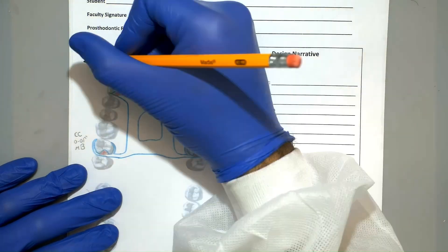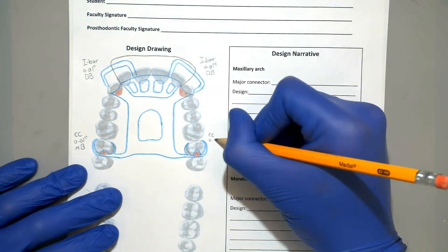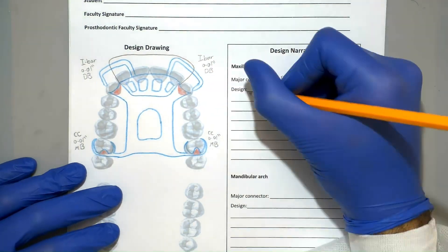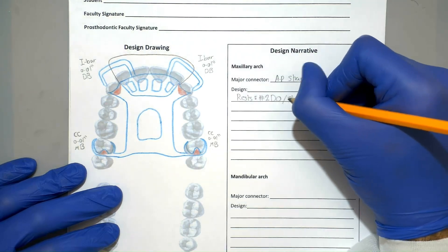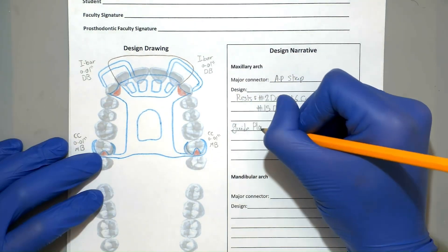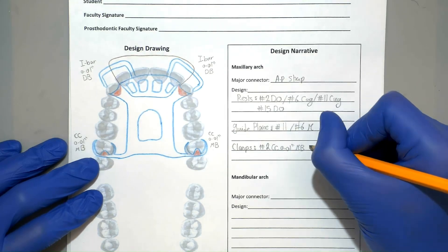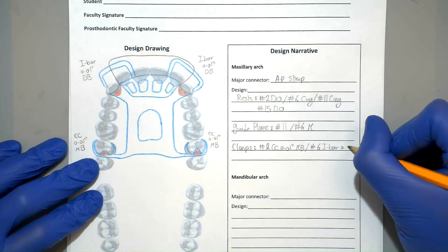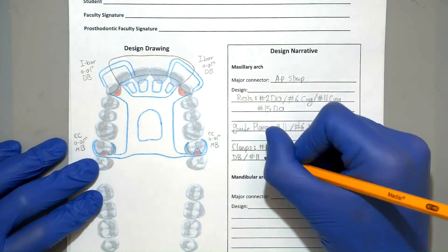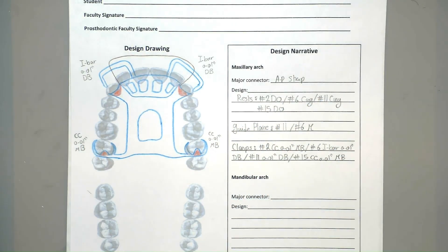We're almost done with the drawing. The only thing left is to write up some information about each clasp next to its drawing, including the type of major connector, the rests, guide planes, as well as clasps.